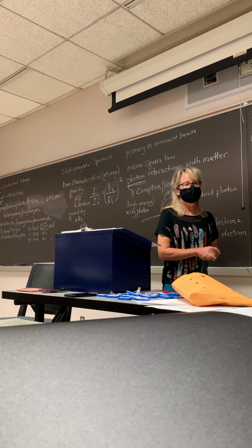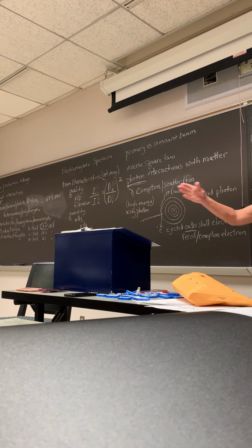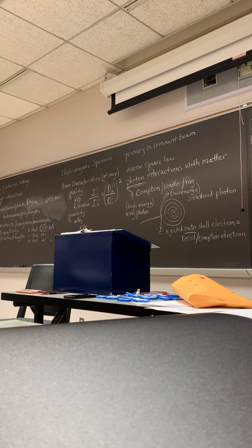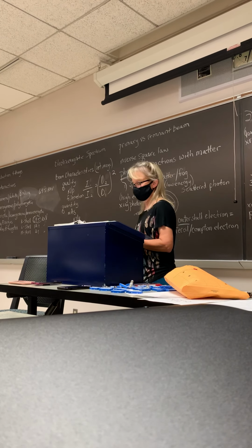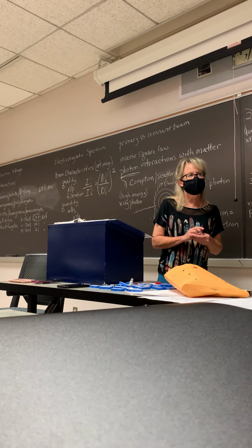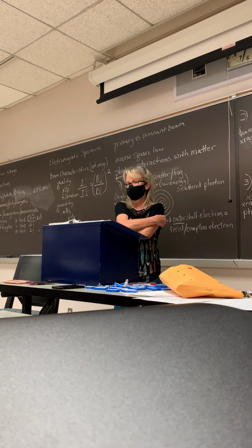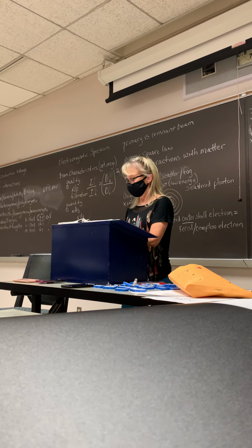It's also influenced by the distance. If I move the tube from 40 inches to 72 inches, what would happen to the quantity? A lot less. They don't get there. So if you increase the distance, the quantity decreases. The last thing that affects the quantity of the beam is filtration. The more filtration, the less the quantity, because you're taking away some photons.